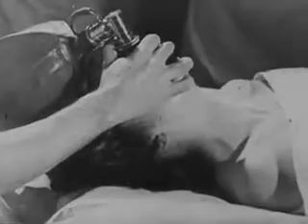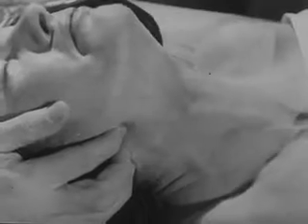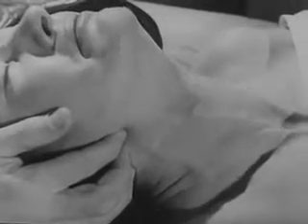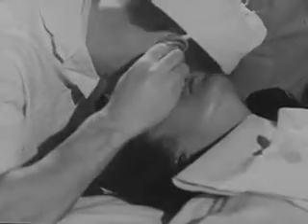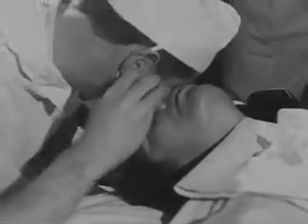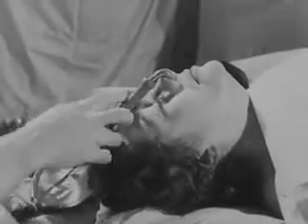Without a free airway, the administration of a general anesthetic is impossible. Obstruction may arise at any part of the air passages, but the greatest danger and the most difficult to deal with is when obstruction occurs at the larynx itself. The popularity of endotracheal anesthesia is therefore easy to understand because its fundamental principle is absolute airway control by intubation of the larynx. Once this control is secured, the difficulties and risks of respiratory obstruction no longer arise.